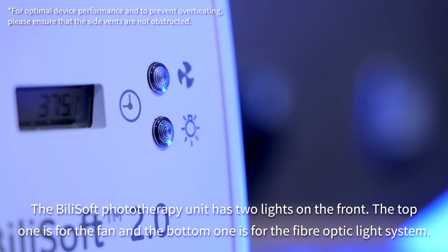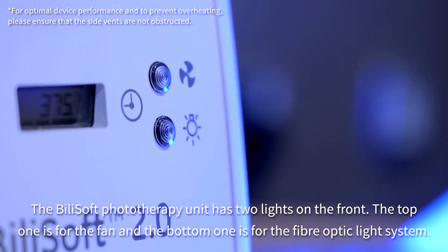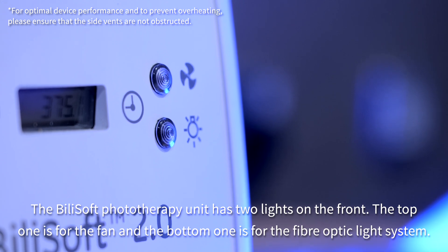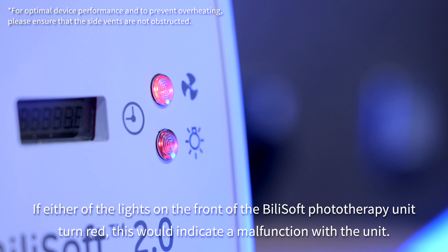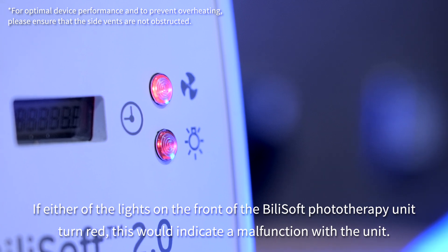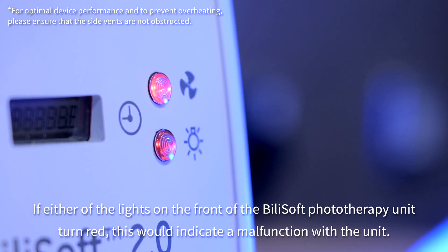The Bilisoft phototherapy unit has two lights on the front. The top one is for the fan and the bottom one is for the fibre optic light system. If either of the lights turn red, this would indicate a malfunction with the unit.